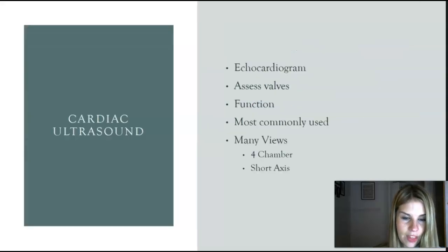Okay, so you might be glad to know that that is the MRI part of the heart done. We're going to move on to some ultrasound now. So specifically cardiac ultrasound, which really is better known as echocardiography. It is actually the most widely used cardiac investigation. It gives really good comprehensive information about the heart, the great vessels, the valves, the size of the chambers, how they're functioning. And really it is very essential in the management and diagnosis of lots of patients who might have some sort of cardiac disease, or they're suspicious that they might have a cardiac event.